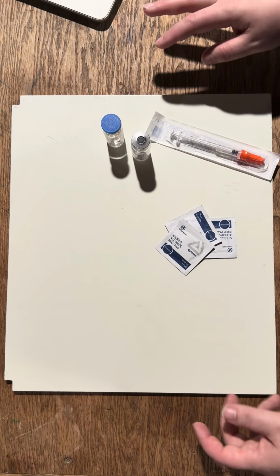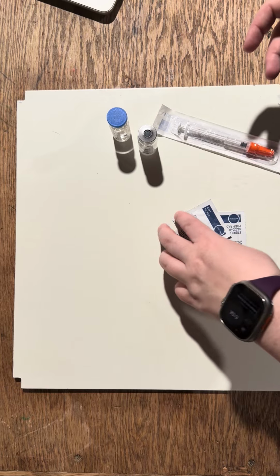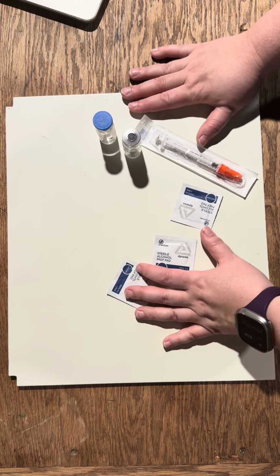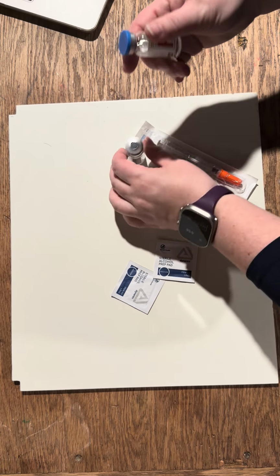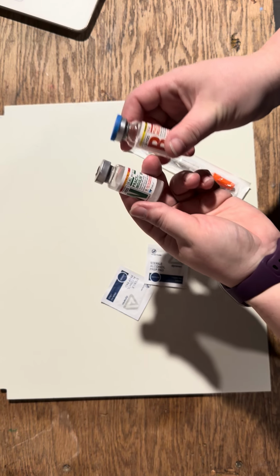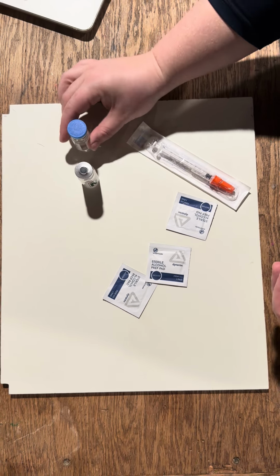I will explain that I'm here to give them their insulin today and ask if they have any questions after I've checked their blood sugar. I gather my supplies, and then I will double check the expiration dates and that it's the correct medication. I will check it against the MAR. Everything seems to be in order.